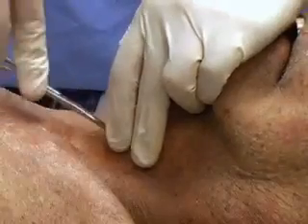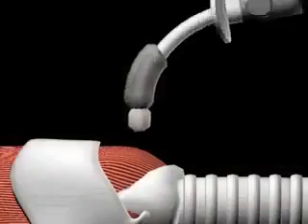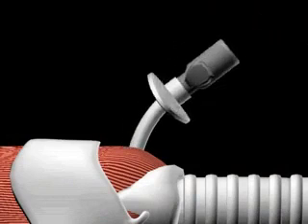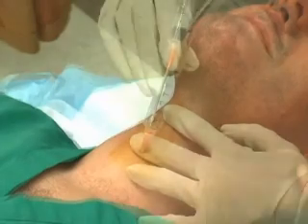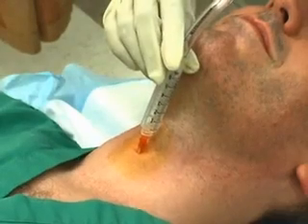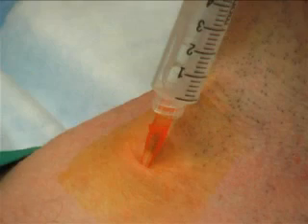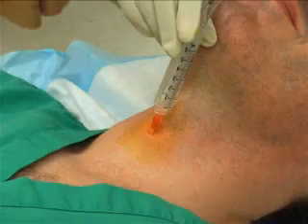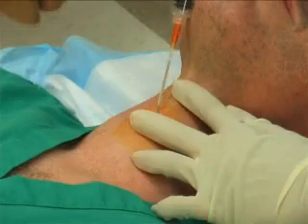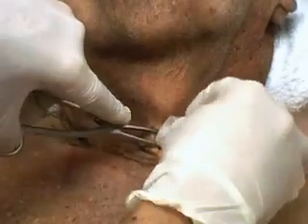This video will demonstrate surgical cricothyroidotomy, which involves placement of a tracheostomy tube through an incision in the cricothyroid membrane. In needle cricothyroidotomy, a catheter is placed over a needle into the cricothyroid membrane, allowing ventilation by a pressurized stream of oxygen. Because the catheter has a smaller diameter, it is less effective in providing adequate ventilation and should only be used as a temporizing measure while preparation is made for surgical cricothyroidotomy or tracheostomy.